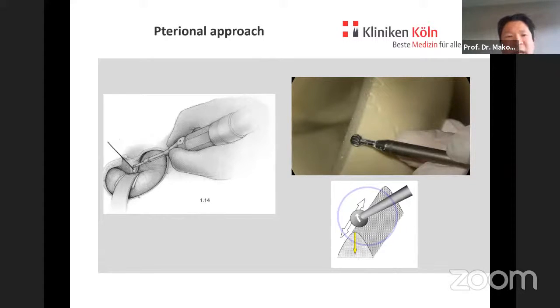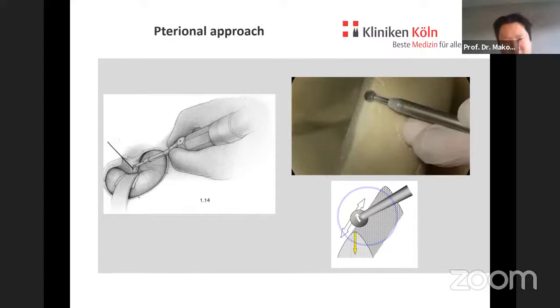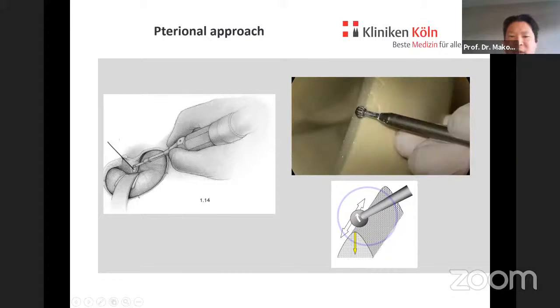Now the drill is on, and now you just drill along the edge into the direction where you anyway want to drill. And so this is a maneuver which is much safer. So even when a wheel effect happens, it will be okay.